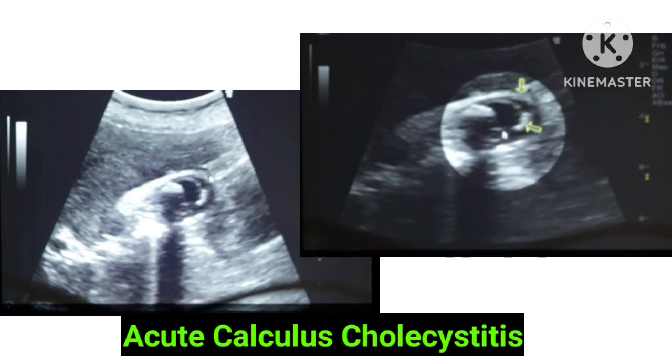This slide shows a gallstone with posterior acoustic shadow, and sandwich appearance of the gallbladder wall, where all three layers are easily seen. Fluid is collected, that is a hypoechoic area, that is pericholecystic fluid collection beyond its anterior wall. All are sonographic features of acute calculous cholecystitis.